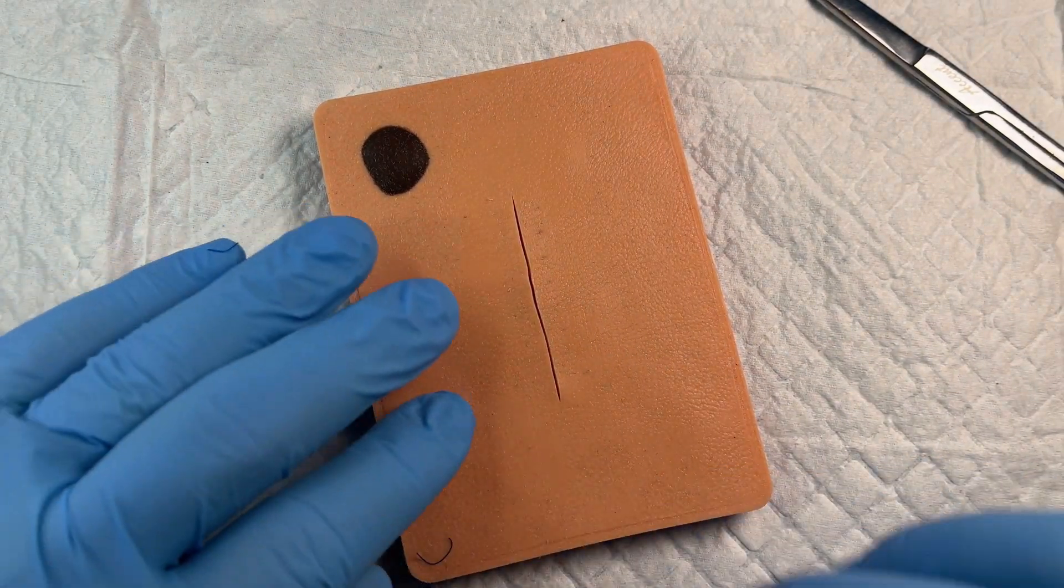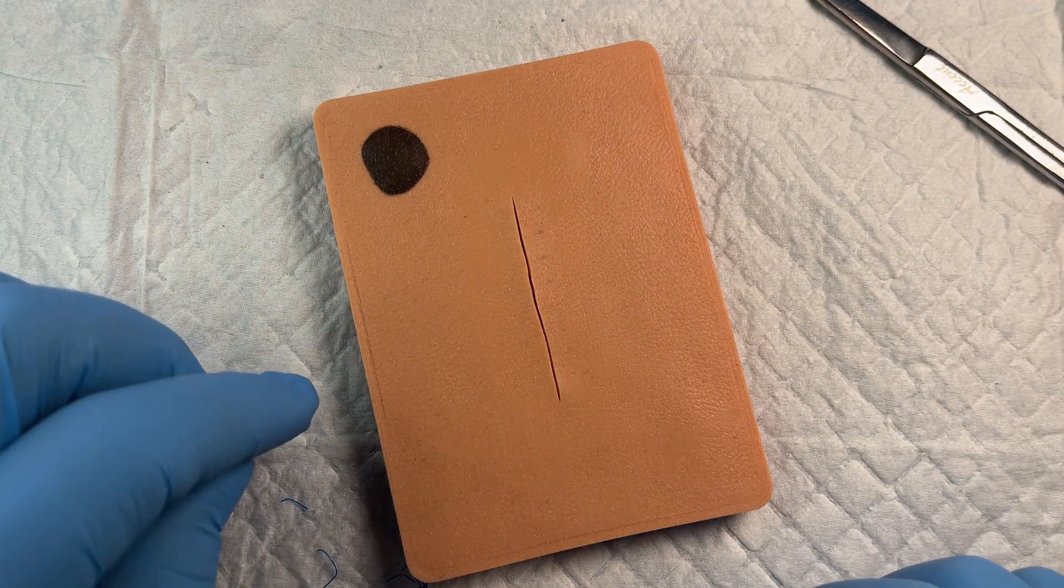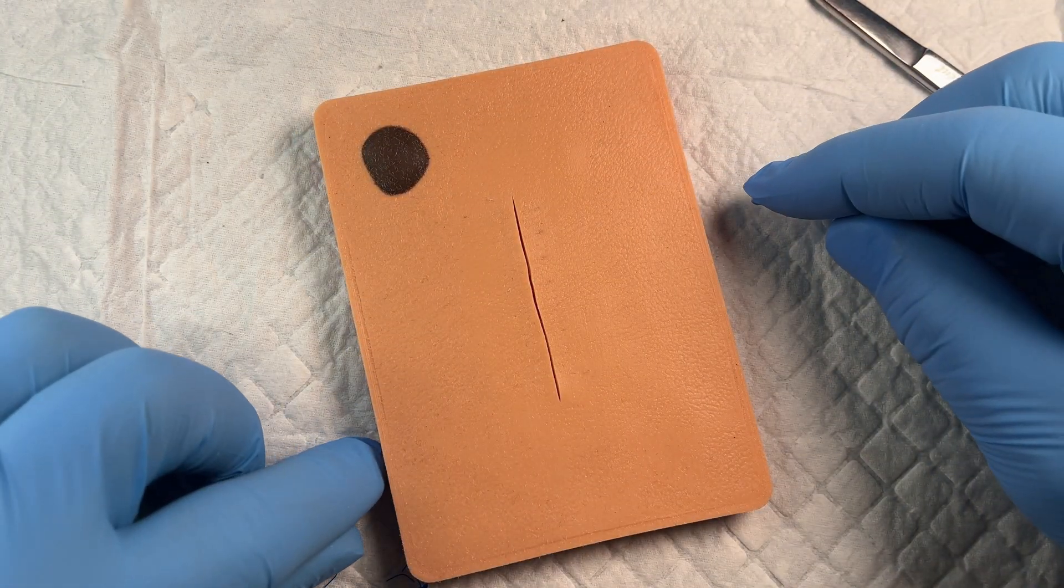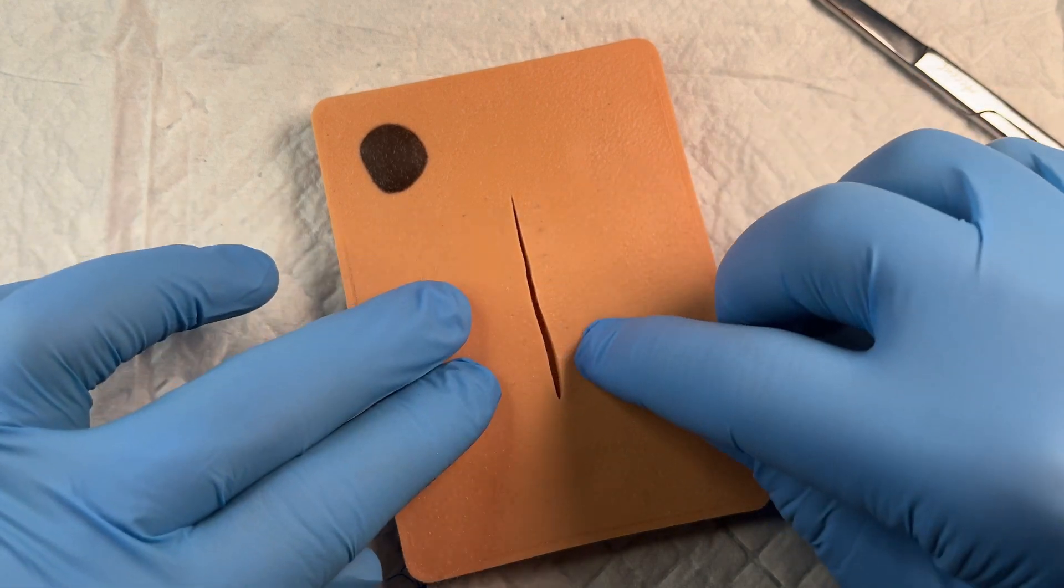And then you would just cover this with a nice clean bandage if needed, depending on the side of the laceration. And it would obviously be better healed than that.